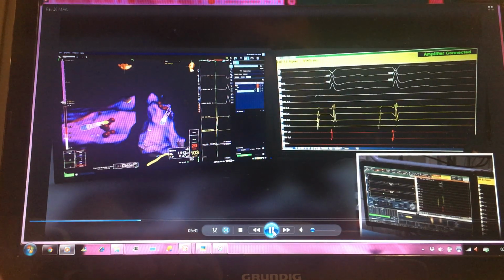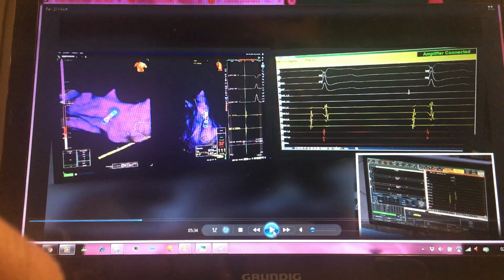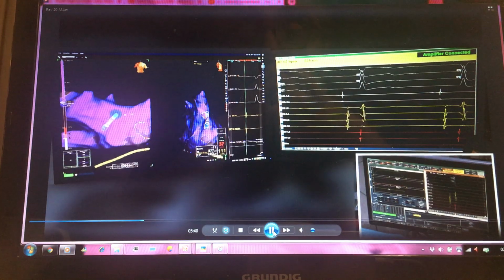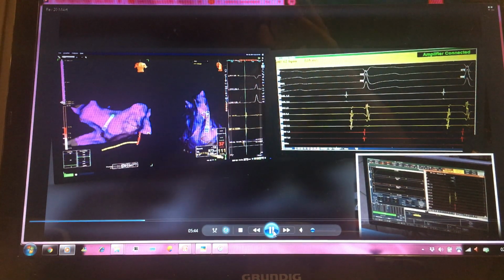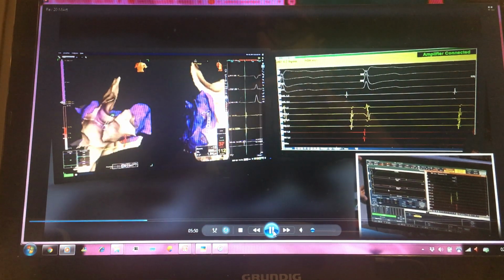Yes, again, bradycardia and AV block. After we complete our ablation at that site, you will not see any additional vagal response in the same area, and it will demonstrate that you completely eliminated those GP sites after RF application. And then we go to the next station.